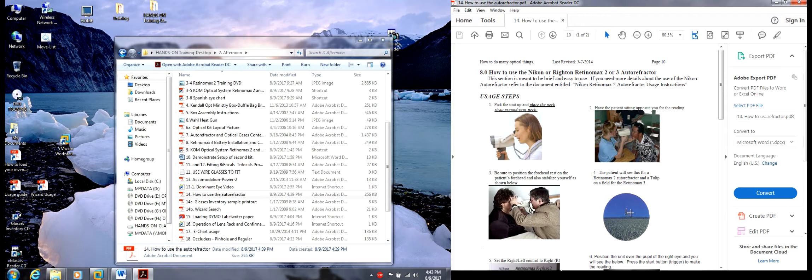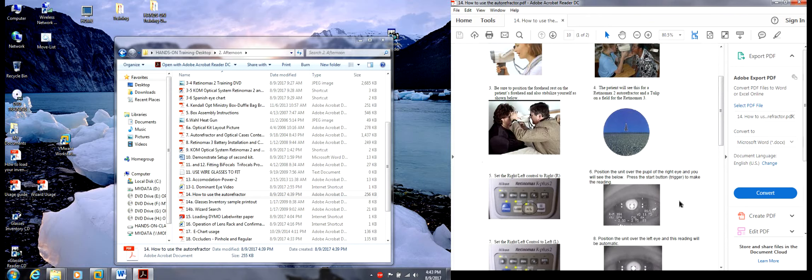You'll see the patient will see a tulip on a field for the Retinomax 3.